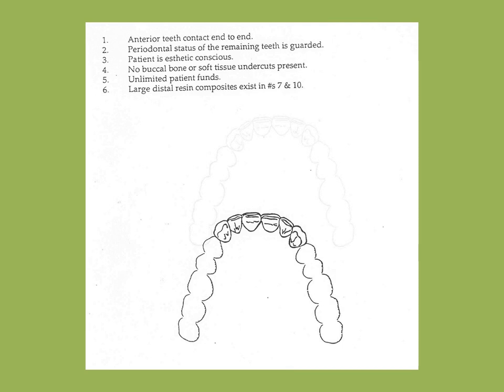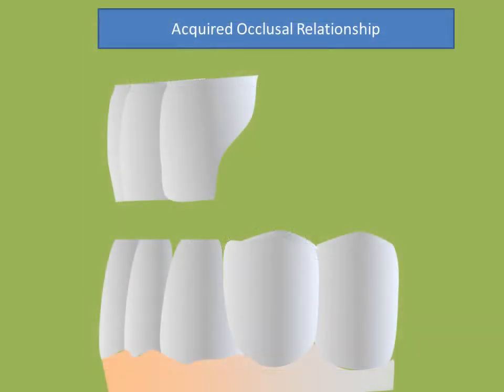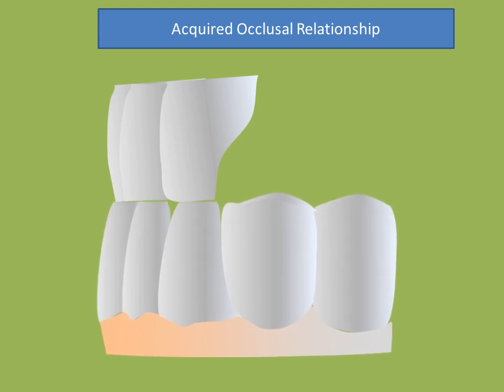There are older stained composite resin restorations in the distal aspect of tooth number 7 and 10. We have examined the cast with the dental surveyor for potential paths of insertion for a removable partial denture. There are no bony defects, undercuts or frenal attachments which would preclude the use of clasps. The patient is willing and able to pay for dental treatment. When asked to close, the patient exhibits an end-to-end occlusion.